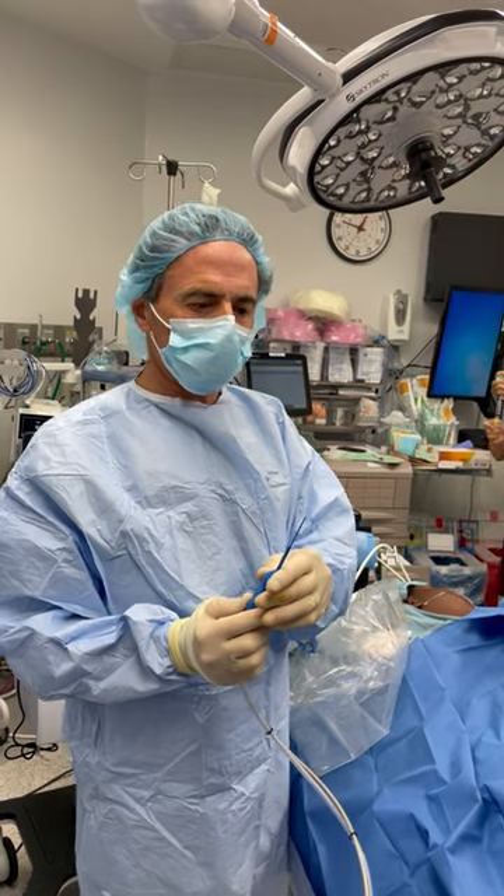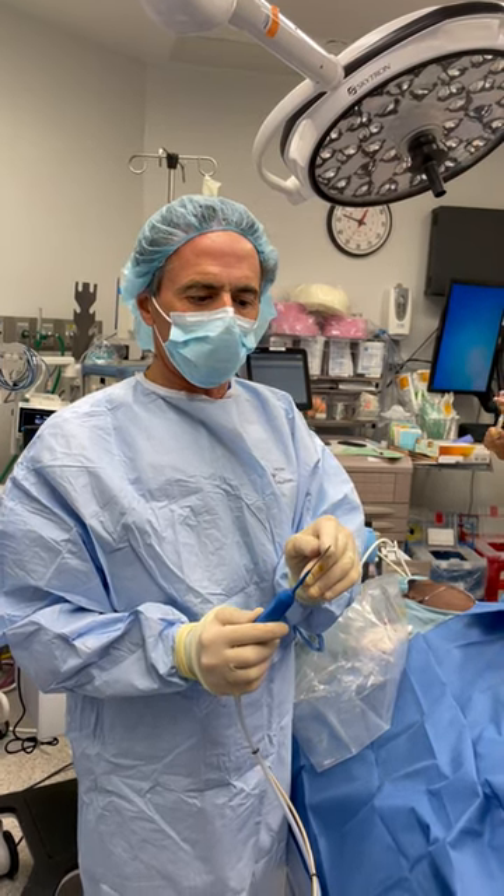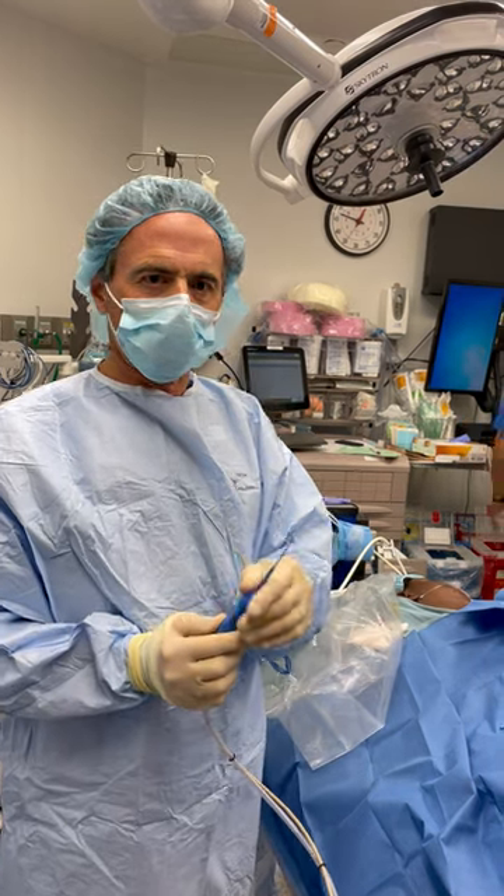This is how the device works. When we press on the button, it sends a jet which is about 2000 beats per second to use water to debris the tissue.